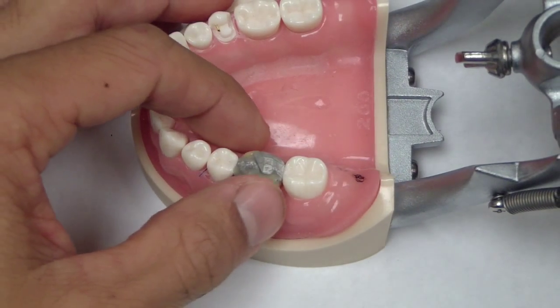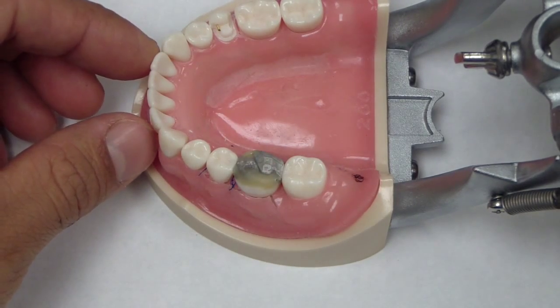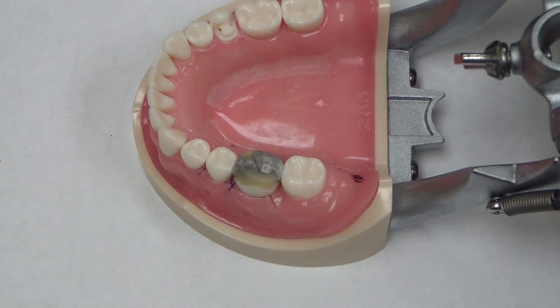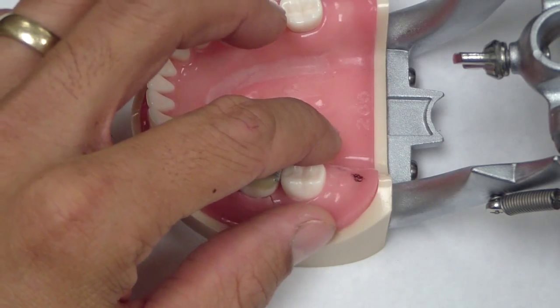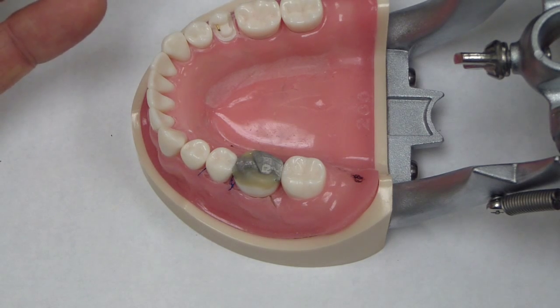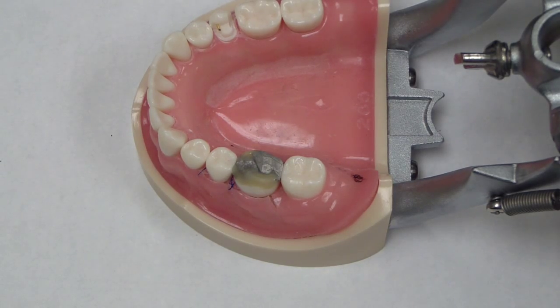Now you can see I've added some flowable — you can use whatever material you want; even wax will work in this situation. I'm building it up to the anatomy I want my provisional to look like and for the appropriate occlusion. At this point I'm going to fabricate a stent, and there are many different ways. You can use just putty, or you could take an alginate impression and pour up a set of models.